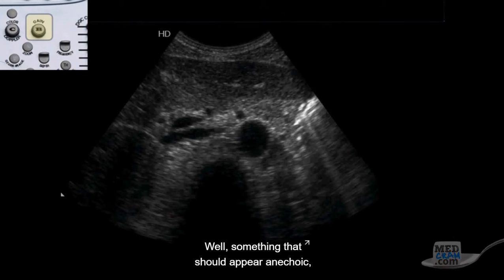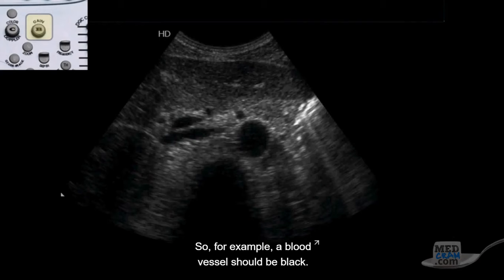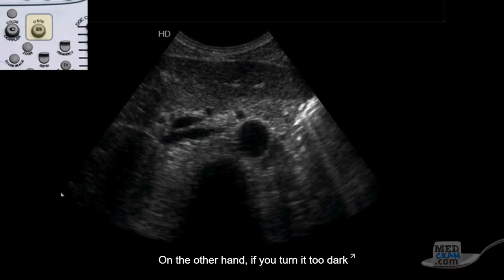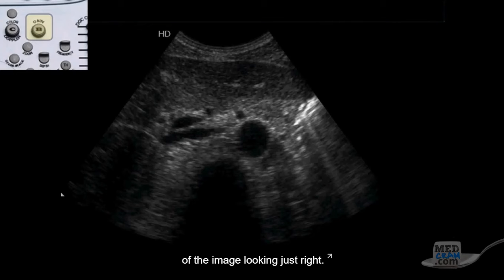Well, something that should appear anechoic, or without echoes, should appear black. So for example, a blood vessel should be black. If you have the gain up too high and you've artificially created echoes, it's too bright. On the other hand, if you turn it too dark to where you're not able to see the structures that you're looking for, it's too black. And so the parenchyma of organs you'll see have typical ultrasound appearances. And the more you scan, the better you'll get at it. You'll need to find that Goldilocks position of the image looking just right.